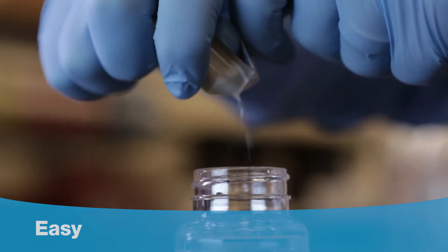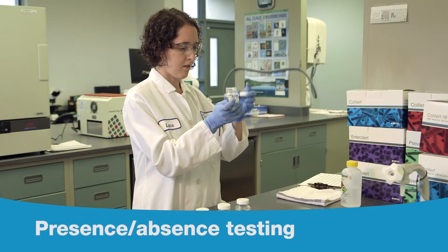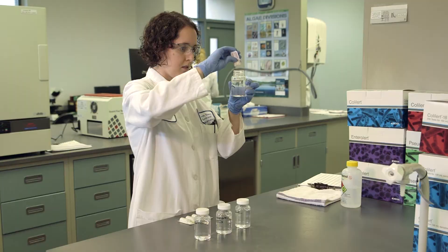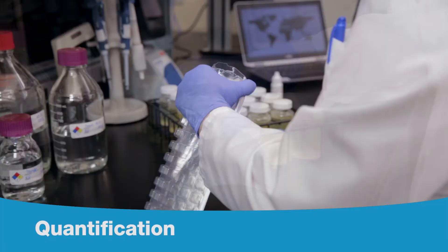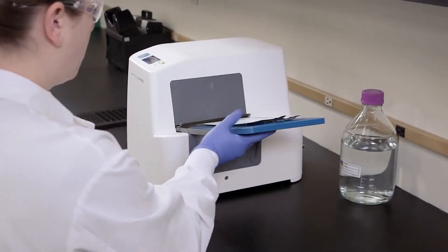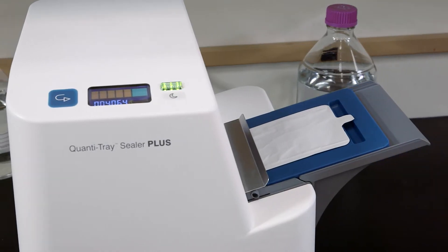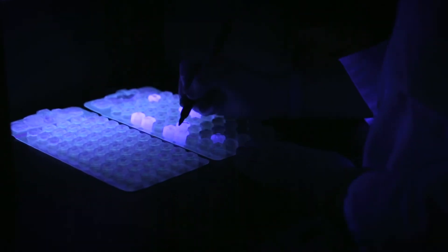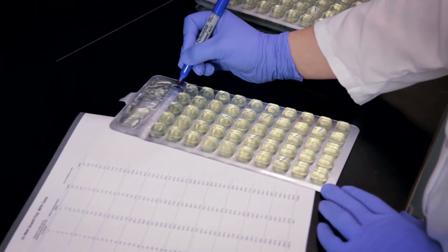It's easy — just a few simple steps. For presence-absence testing, simply add the ready-to-use IDEXX reagent to your sample and incubate. For quantification, pour the reagent and sample into a Quantitray, seal the tray in the Quantitray Sealer Plus, and incubate. Your results can be ready in as little as 18 hours, with less than a minute of hands-on time.